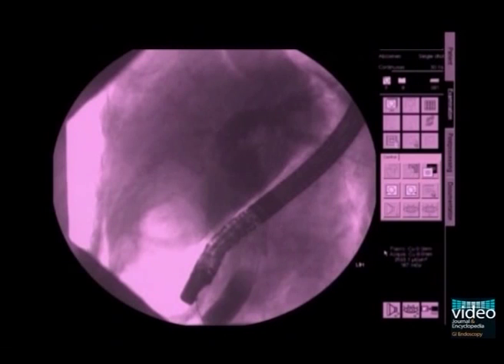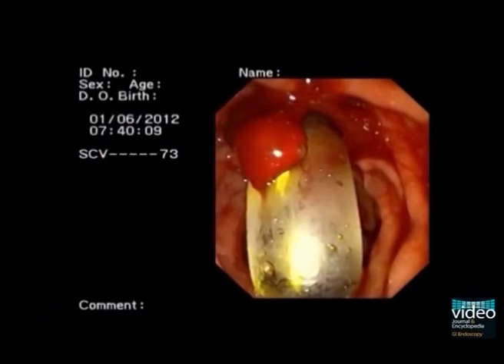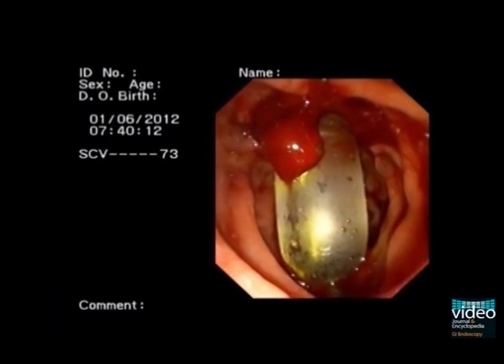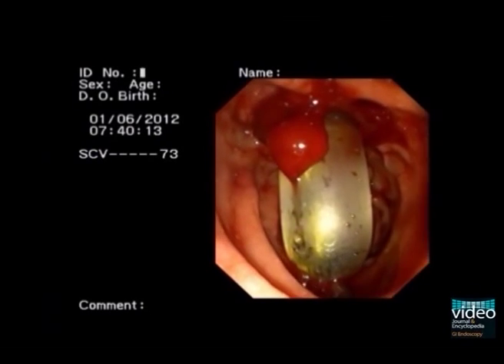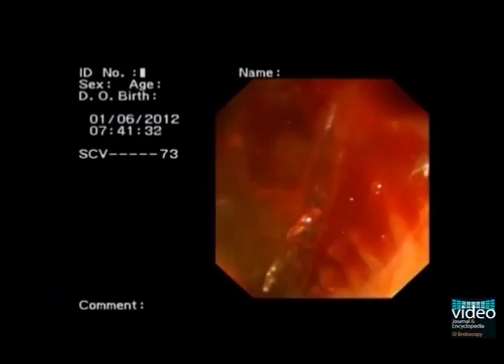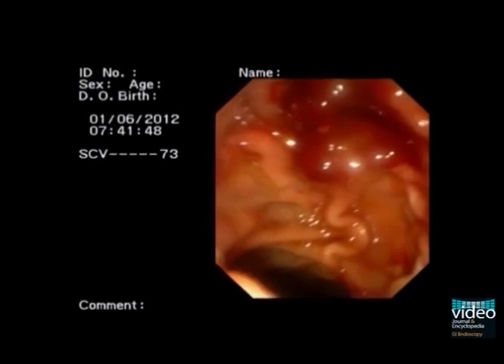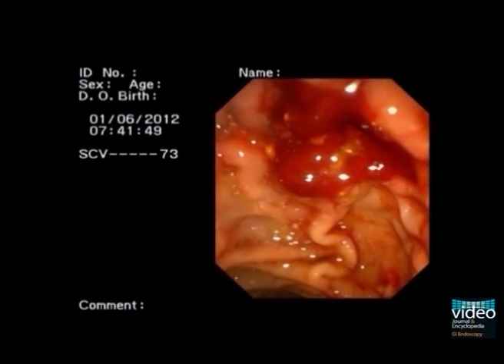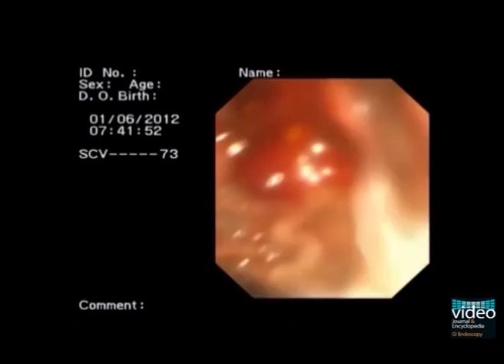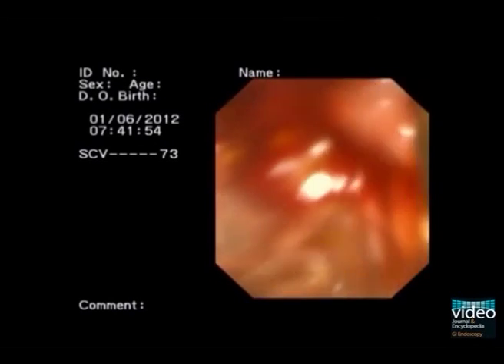A clot has been formed. The balloon is retrieved. A stone extraction balloon is inserted.